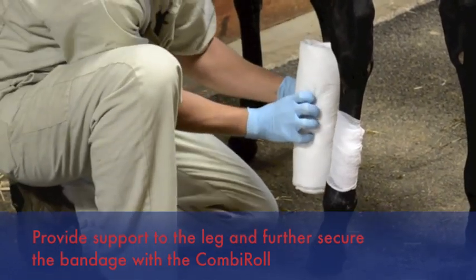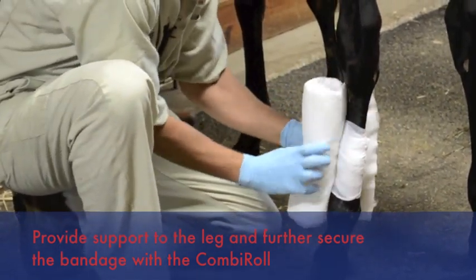We apply our combi roll in the same direction, wrapped away from the body on the outside of the leg.